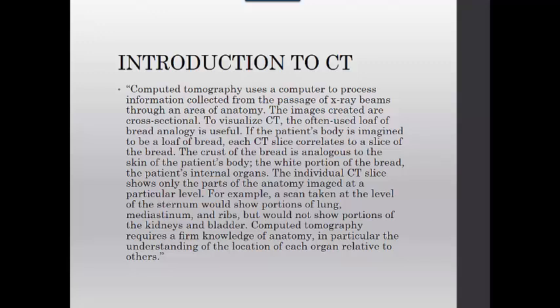To visualize CT, the often used loaf of bread analogy is useful. If the patient's body is imagined to be a loaf of bread, each CT slice correlates to a slice of that bread. The crust of the bread is analogous to the skin of the patient's body, and the white portion of the bread is the patient's internal organs.